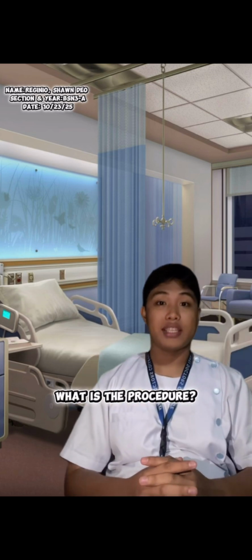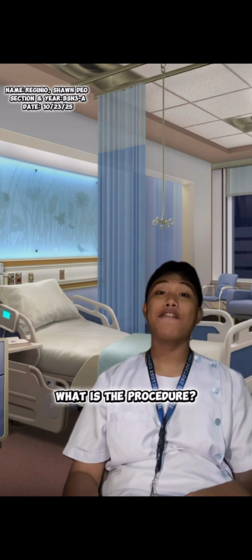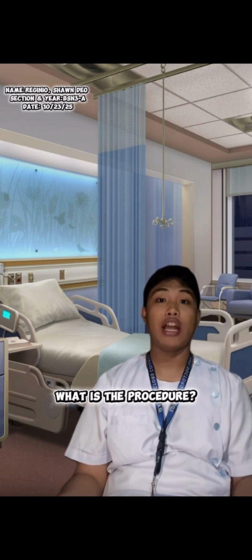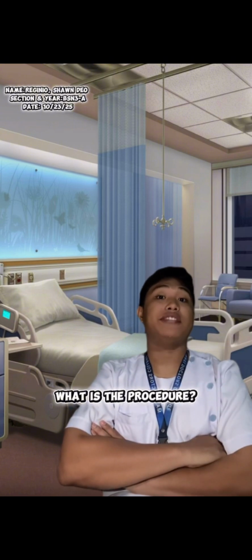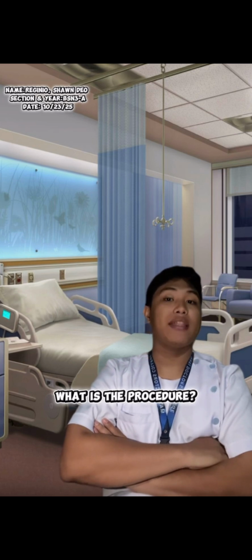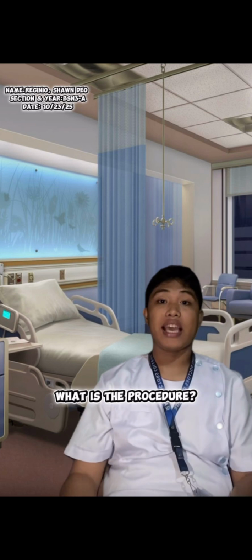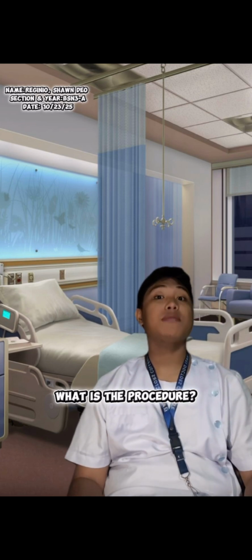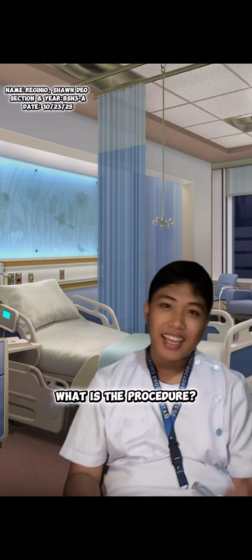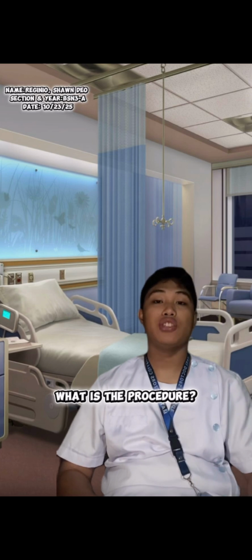Fourth, remove the old dressing to check the area for infection. Fifth, clean the area with a saline cotton applicator to remove the mucus and dirt. Sixth, suction the mucus if needed to help the patient breathe better. Seventh, put on a new clean dressing and secure the tube in place. Eighth, observe the patient's breathing and comfort. And last, record and document what you did.